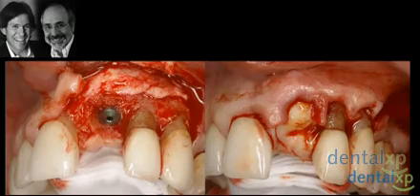of compromised aesthetics. Now what we did is brought the patient back in and went down to the implant. One of the interesting things in this case was that if you see here in the labial aspect, we actually have good bone. Bone here is actually quite good, David. We have 2 millimeters in front of the implant. We're about 1.5 millimeters from the lateral incisor, so although it looked quite close, I think we're okay here.